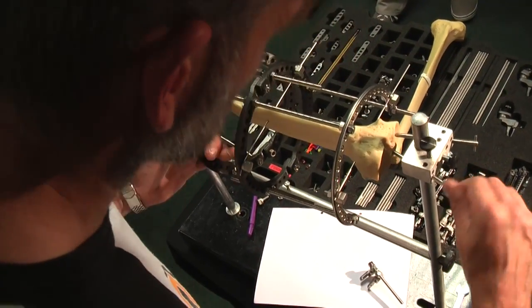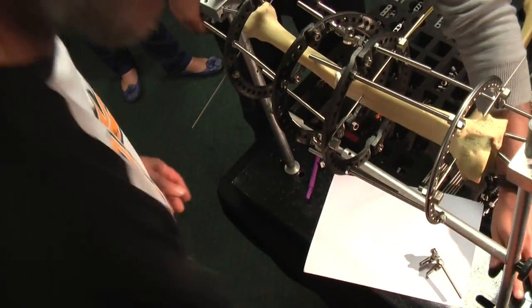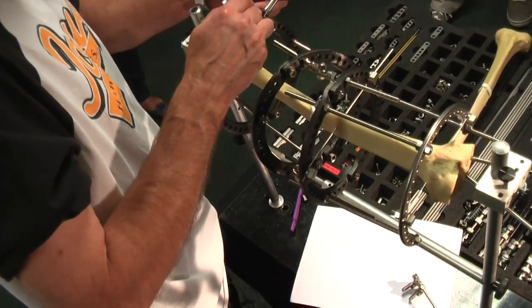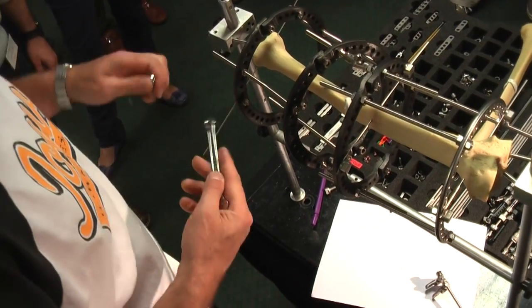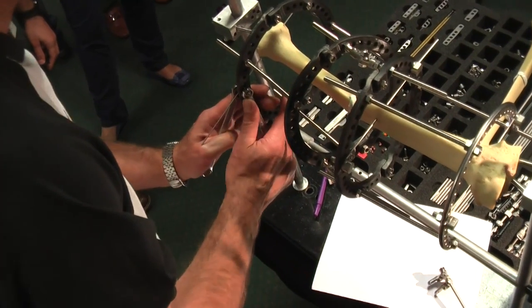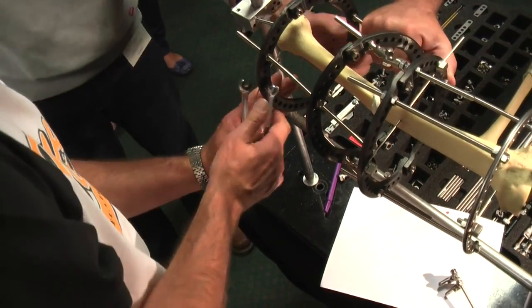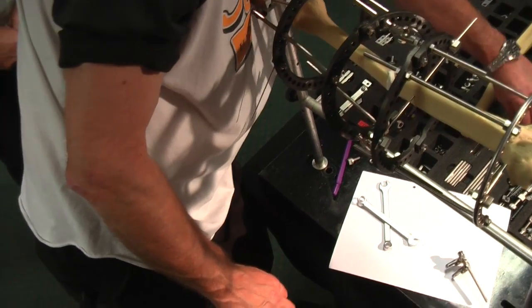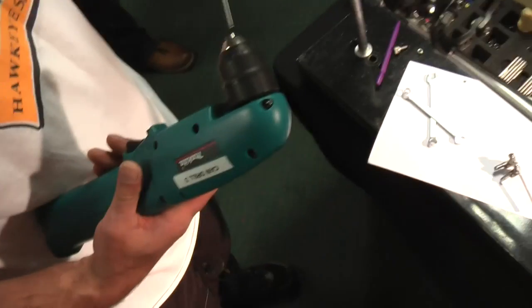And in the interests of speed, we will hide some spanners. Those spanners. If we just nip up this bottom wire here, okay, and we'll just drop one more wire in here just so we've got enough stability in the frame to make it do what we need to do.